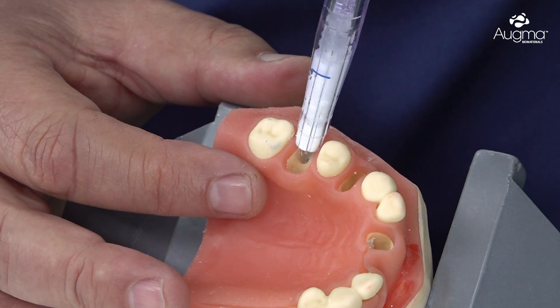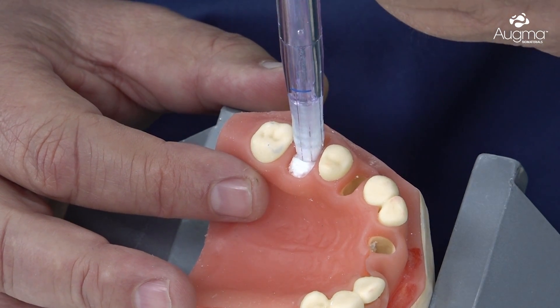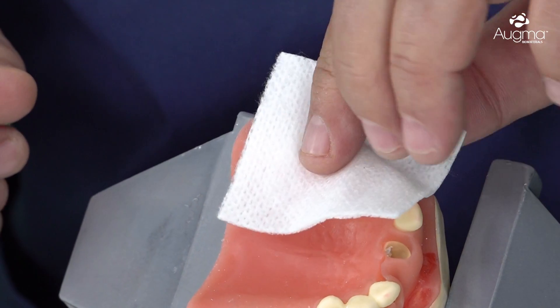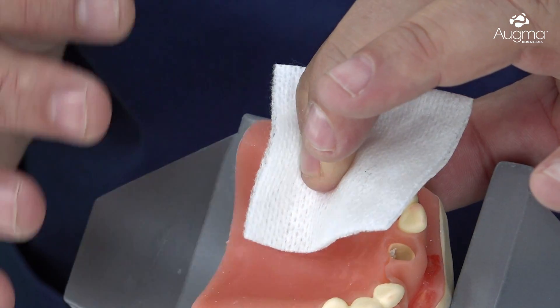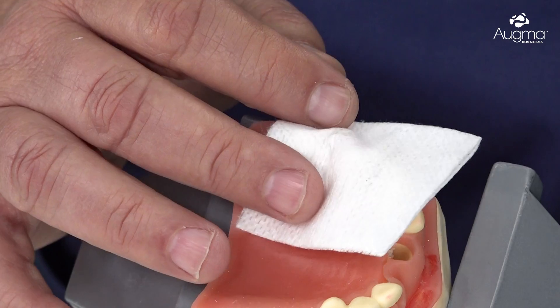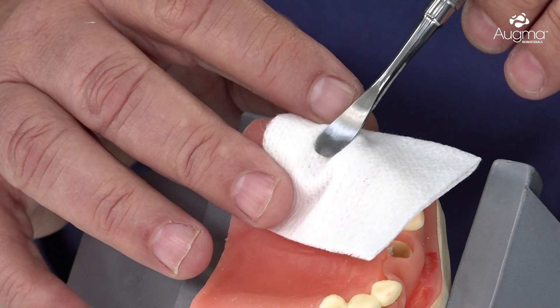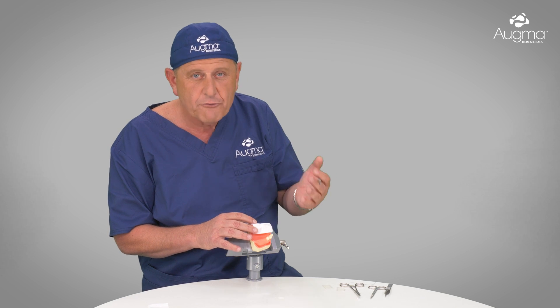Now we inject the content of the syringe into the socket. Immediately after, we take a dry unfolded gauze and press it firmly with our finger for 3 seconds. But that's not enough — we then remove the finger and use the periosteal elevator in order to add additional compaction.